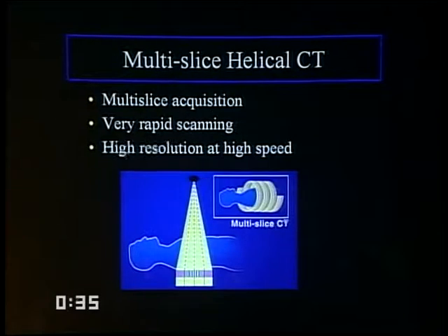On the other hand, with multi-detector, whether it's 4 rows or more, we're in a position to routinely use thin collimation in the order of 1 millimeter. Multiple studies have shown that thinner sections are definitely better for diagnosing pulmonary embolism, all other things being equal. So we would now, by preference, use a high-speed, high-resolution protocol with 4 cc's of contrast per second.